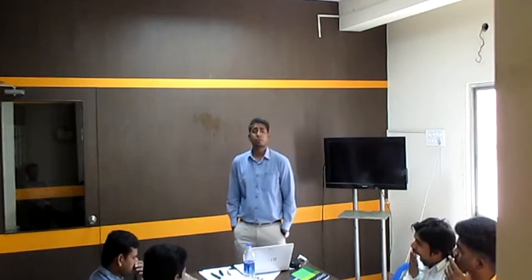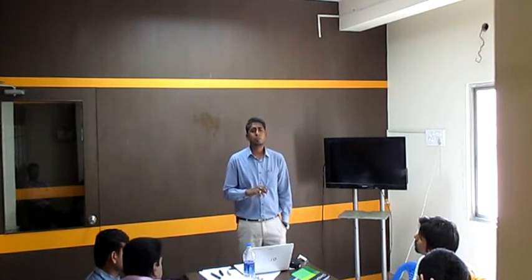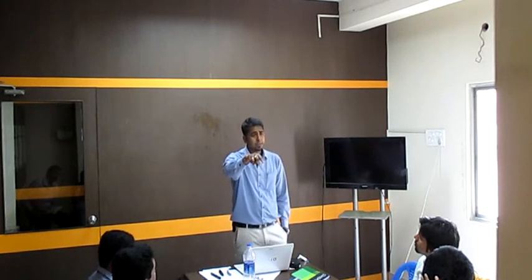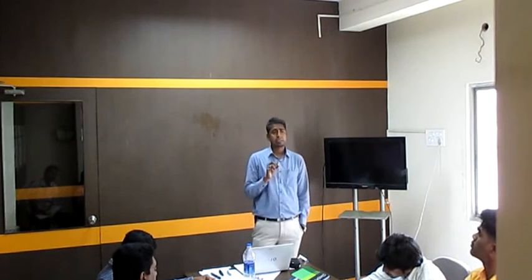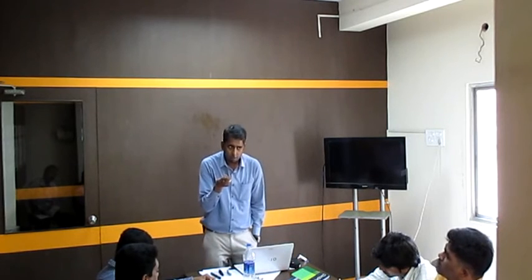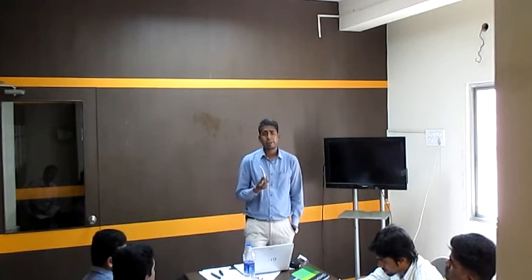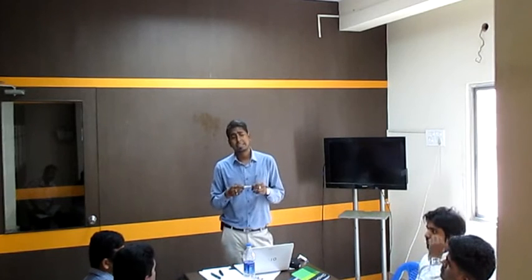Now the working of your handpieces. One of the most common things, you add one more parameter in performance parameters, that is tactile sensation. Tactile means touch, and sensation means feel. We always expect that our handpiece should offer a very good tactile sensation.